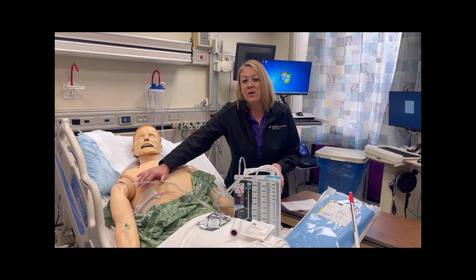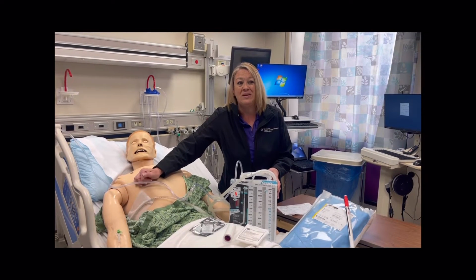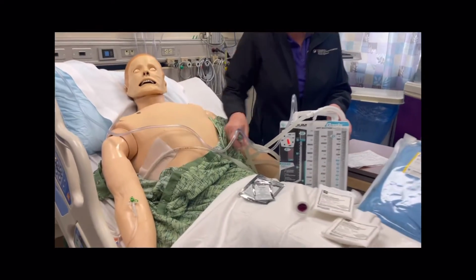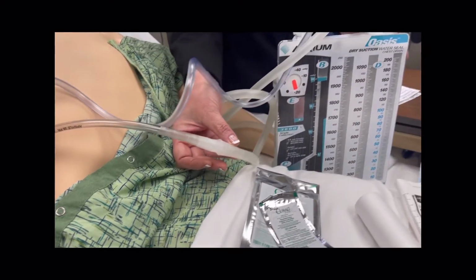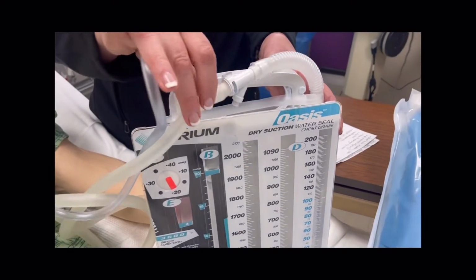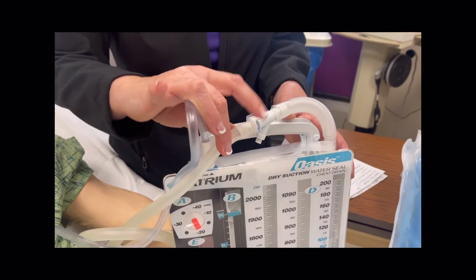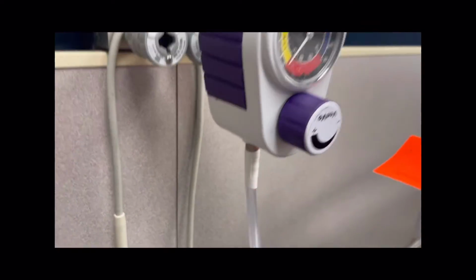Some of the things that we can do to also help prevent pneumothorax is to check our connections. This should be done every shift. You want to check your connection at the patient, check your connections from the chest tube to the drainage tubing. And again, just like I noted before, check your connection where it connects to the patient. And finally, we're going to check the connection at the suction tubing and make sure that that's attached.